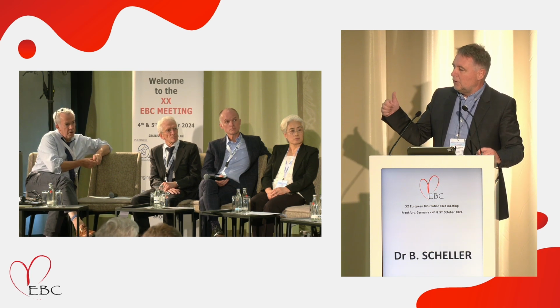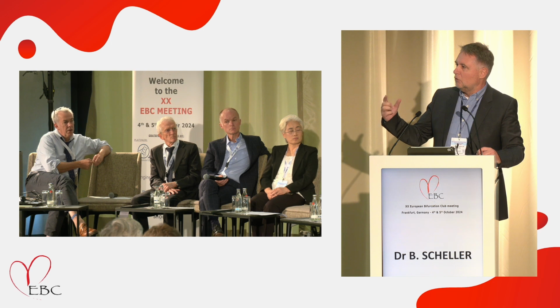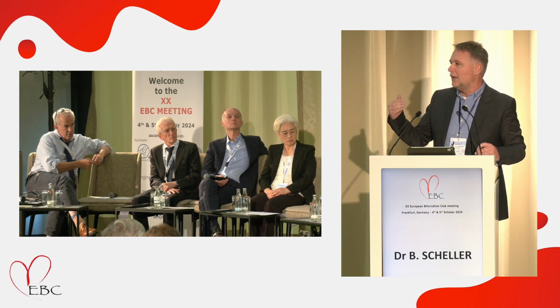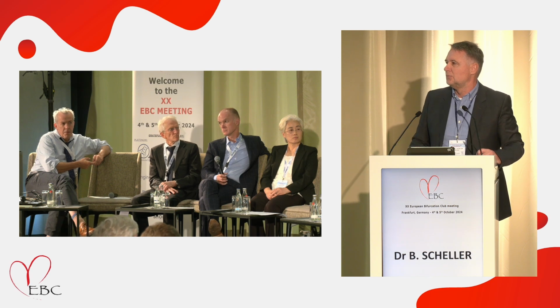This is one mechanism, but the more important mechanism is the improvement of the total vessel when looking at this lumen enlargement. So plaque regression is a nice to have, but not the most important factor, I think.